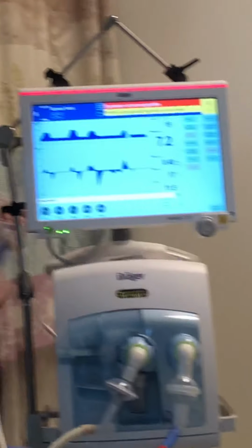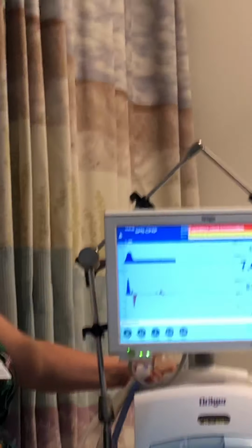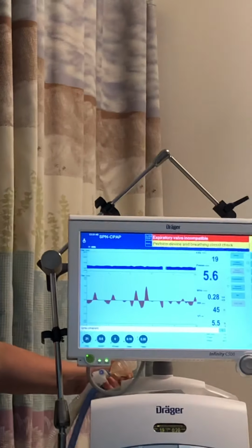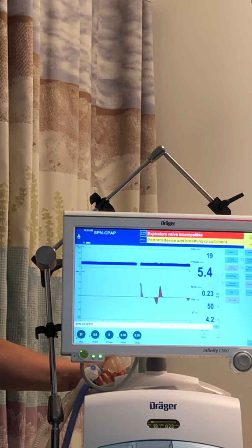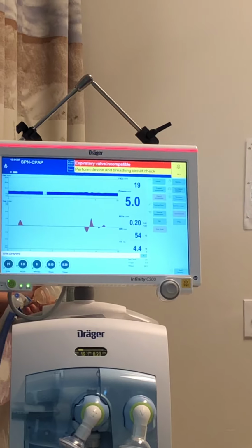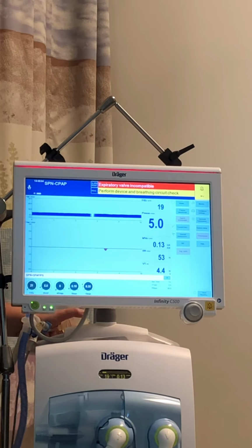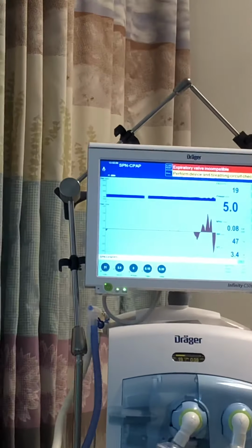Hold on, I went into apnea. I'm sorry. I don't think that is pressure support.